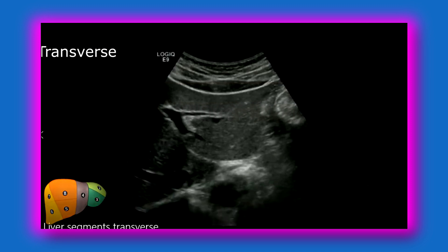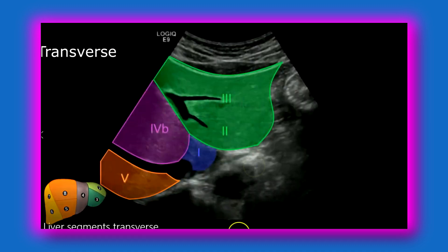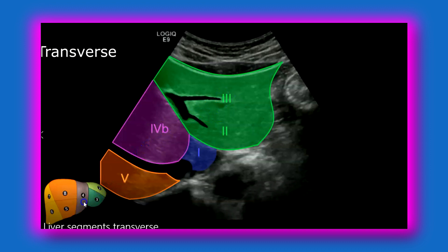Now we're angling from inferior to superior. Here you're going to have the portal vein branch feeding segment 3, the portal vein branch feeding segment 2, the caudate lobe — segment 1 — segment 4B, and segment 5. Closer to the transverse face you're going to see the inferior segments of the liver: 3, 4B, and as you go more posteriorly you'll start getting 2 and 5, as well as the caudate lobe, which is behind here.